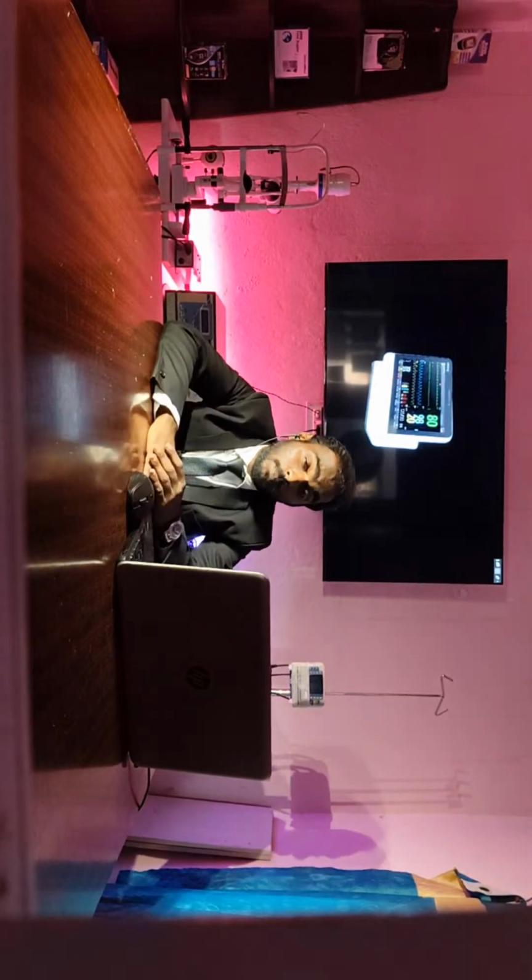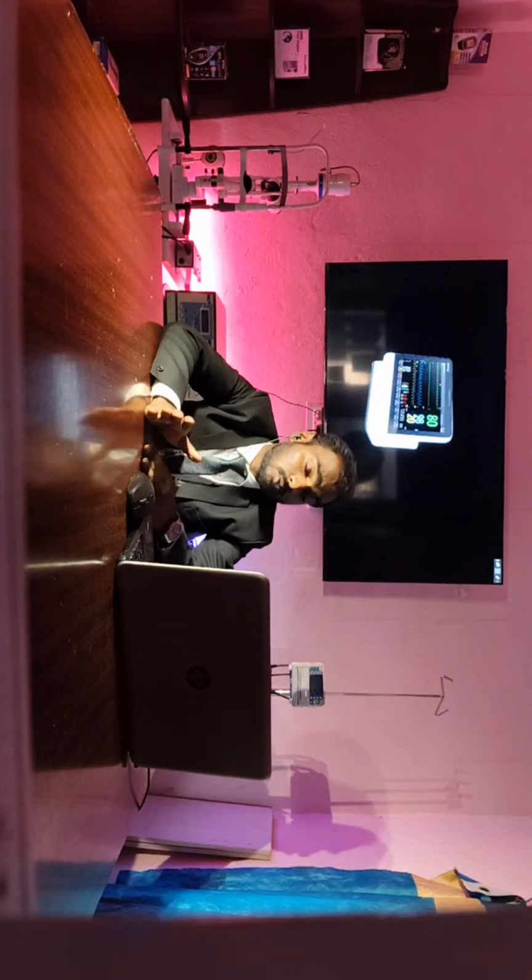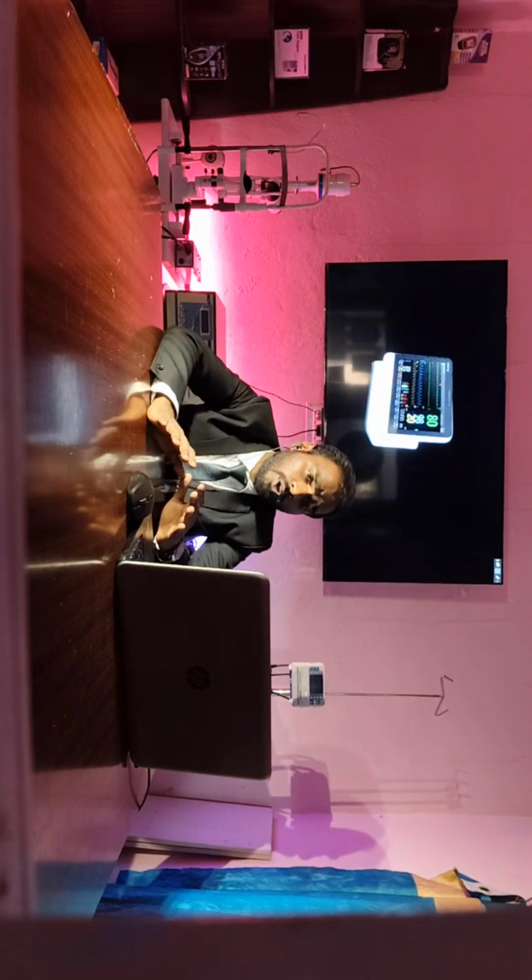So temperature, as I said, and BP. When it comes to BP, that is blood pressure, we can take it in 2 types: one is NIBP and the other is IBP. Non-invasive blood pressure is called NIBP, and IBP is invasive blood pressure. So what is NIBP? NI is non-invasive. We ensure that we are not going to puncture the skin, and it is a painless procedure.